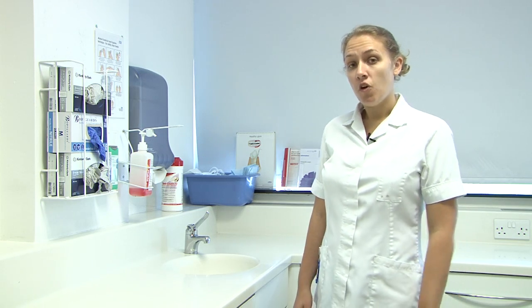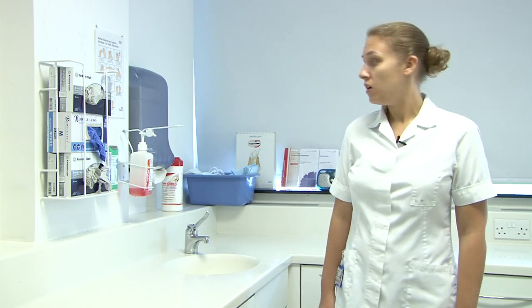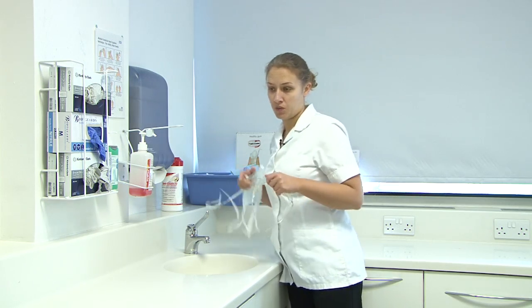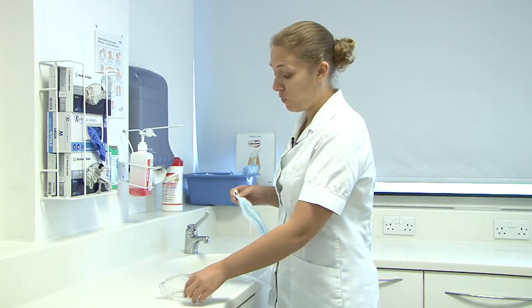At the start of each clinical session we need to prepare our bay. We need to disinfect our work surfaces and our chairs. Before we disinfect our bay we need to put our PPE on, which is our goggles, masks and gloves. We put our goggles and our masks on first so we're not touching our hair with gloved hands.